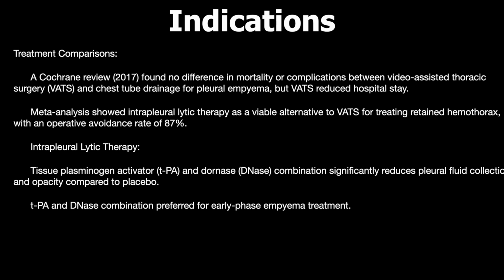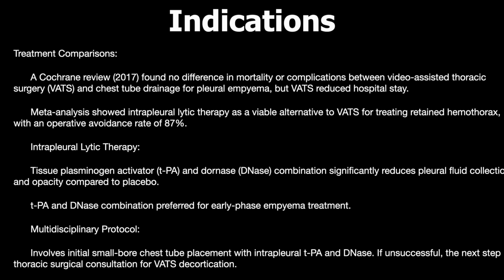Now, the tissue plasminogen activator and DNase combination given in the early phase of empyema treatment is beneficial. Regarding the multidisciplinary protocols involving small bore chest tubes with intrapleural plasminogen activators and DNases, if unsuccessful, the next step could be VATS. So next is types of chest tubes.